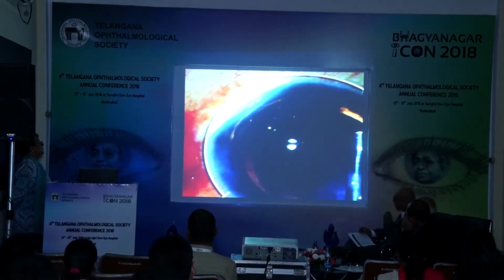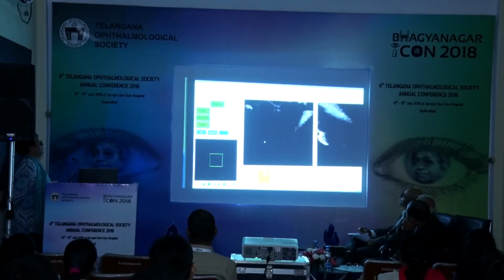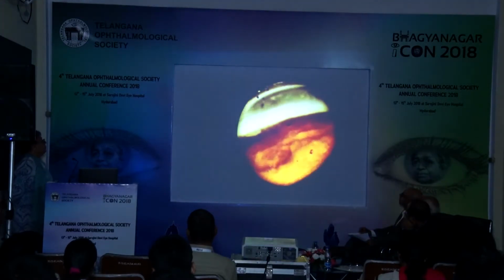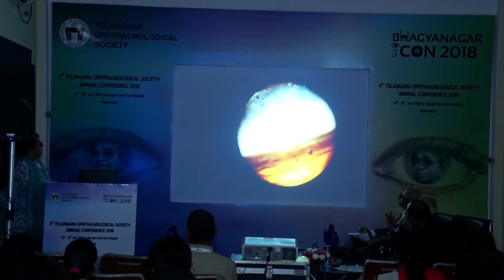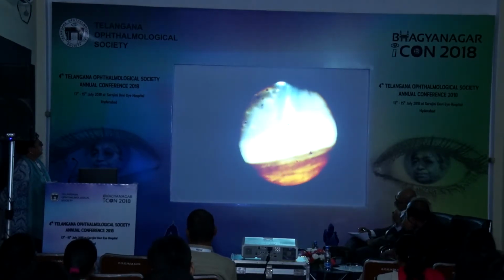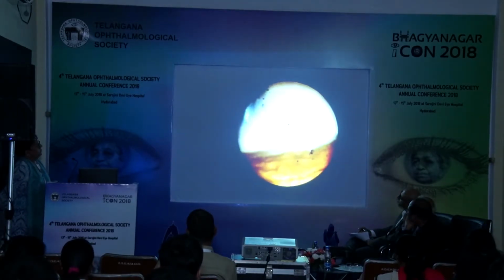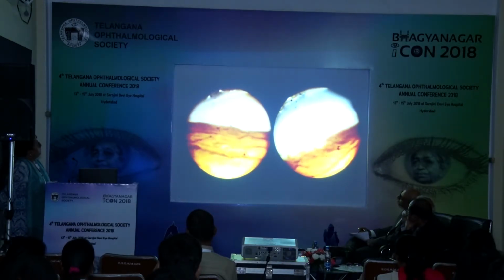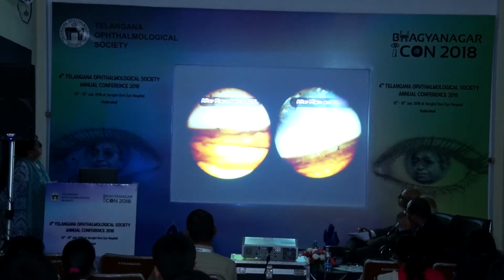Once laser is completed, intraoperative ASOCT is repeated as seen here. Following this, the endoscope is reintroduced into the AC to visualize the angle yet again. Post-endocycloplasty, the scleral spur is now visible throughout the inferior 180 degrees. This is in stark contrast to the view after phaco and immediately prior to endocycloplasty.